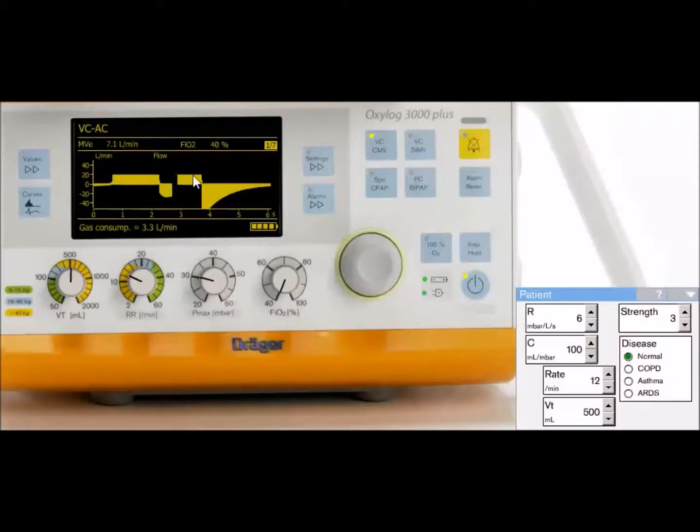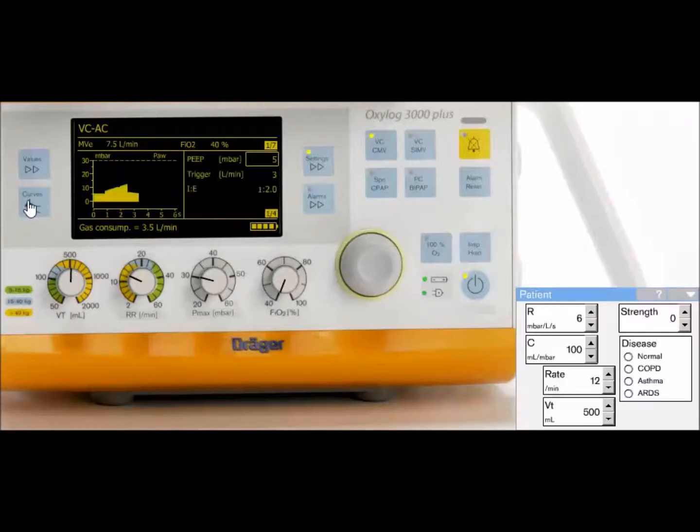So here's my flow waveform. I don't want to go back and show you that it didn't increase. I'm just going to turn this off again. I'm going to turn this back to 0 so the patient's not breathing at all. And if we go back to my curves, let's just go down to my I:E ratio, and as you notice, my flow rate is set at 19, approximately 20. Now let's go back to my waveform curves. My big waveforms, you notice my flow rate is 20.